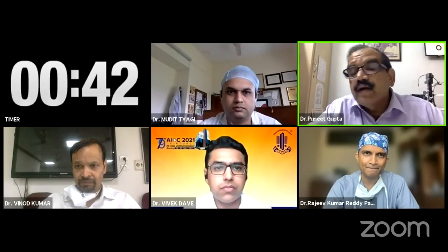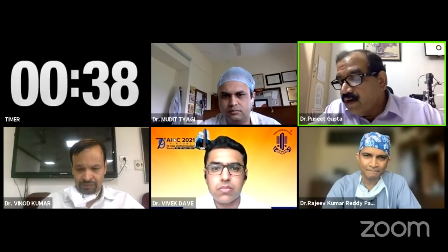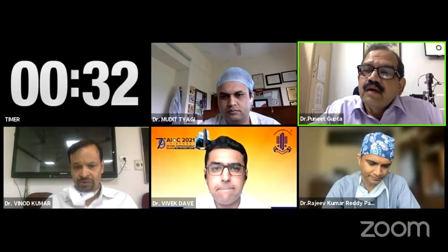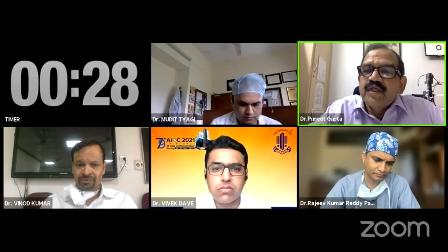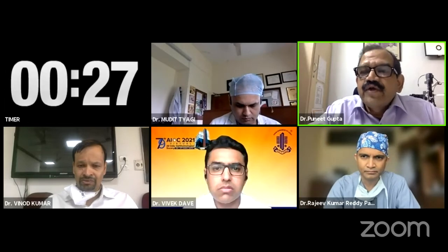Puneet, do you have anything else to add? I think about Dr. Vinod's talk about the learning curve. Anybody who is starting to use the endoscope and learn this technique can use the endoscope as a light source in every surgery, especially the 23 gauge one, so that they can have an idea how the structures look on the screen in front of them.